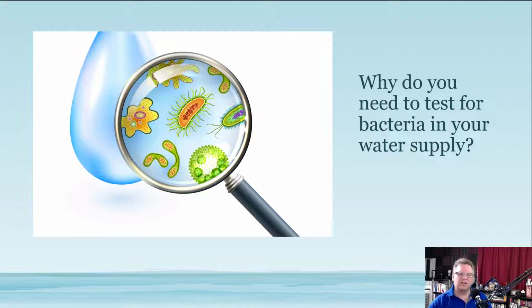So first off, we always like to start with why. If you're a Simon Sinek fan like I am, always begin with why. You need to know why you're testing for bacteria in your water supply. So let's discover that. First off, you can't see the germs in the water.